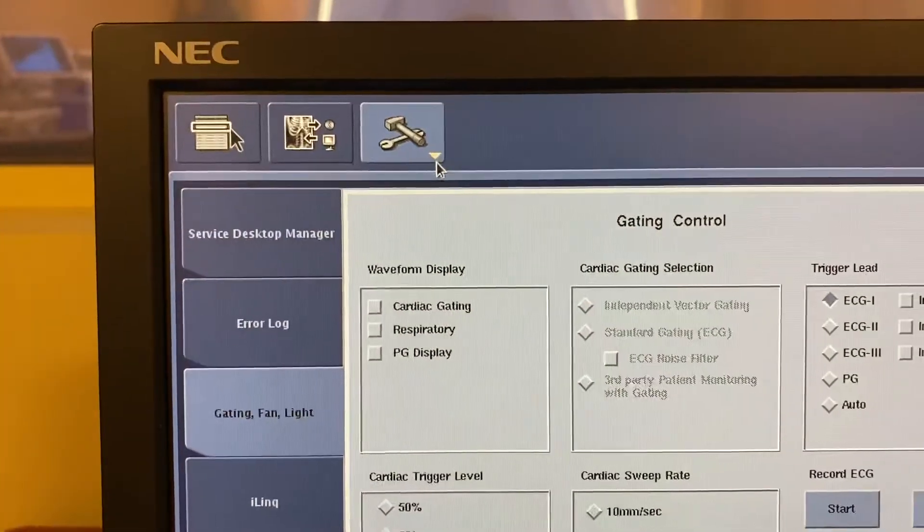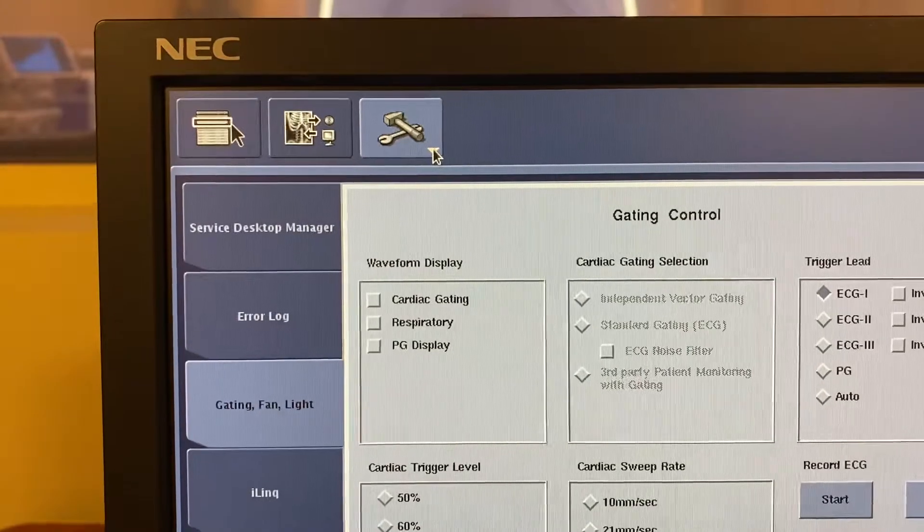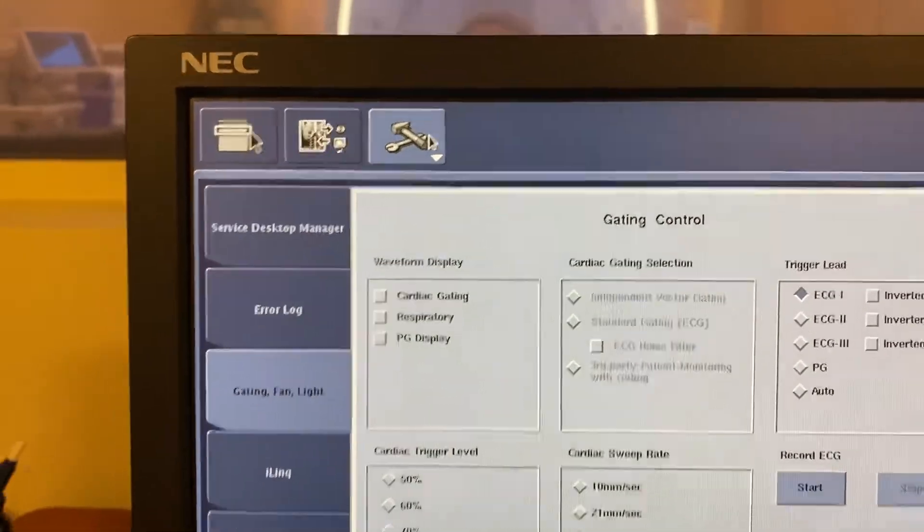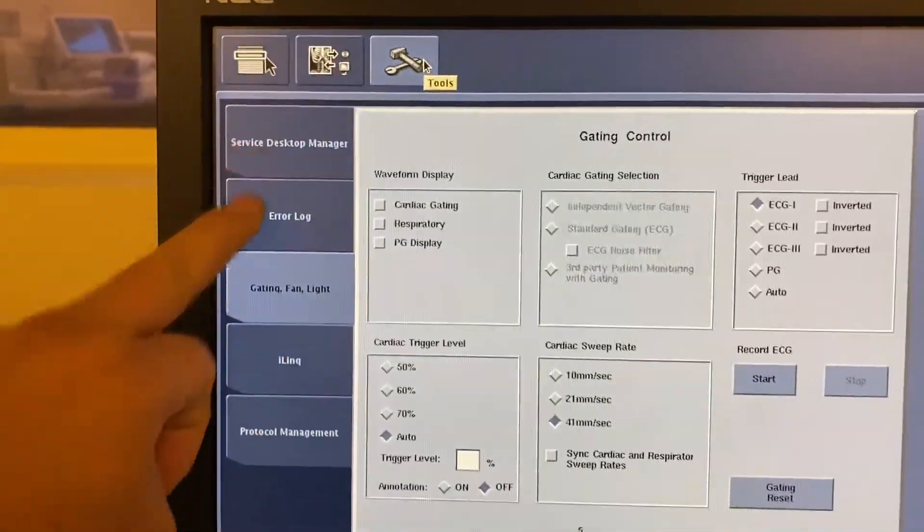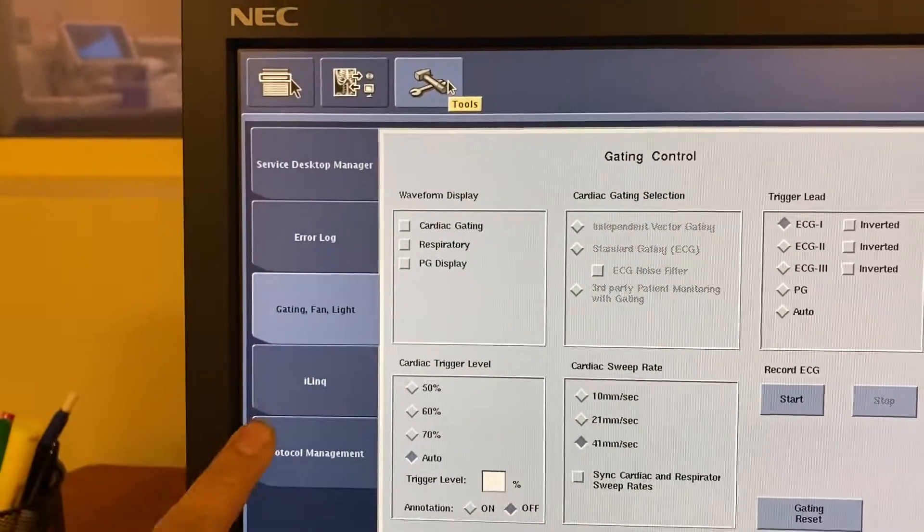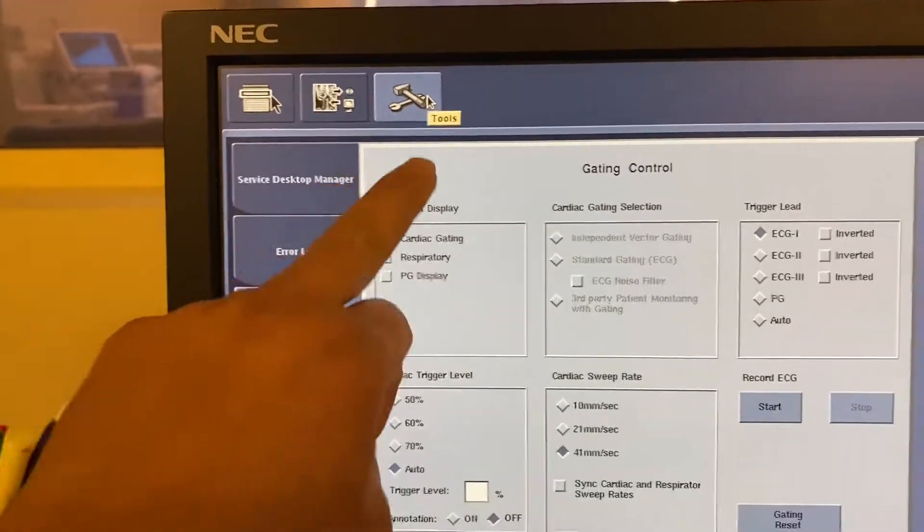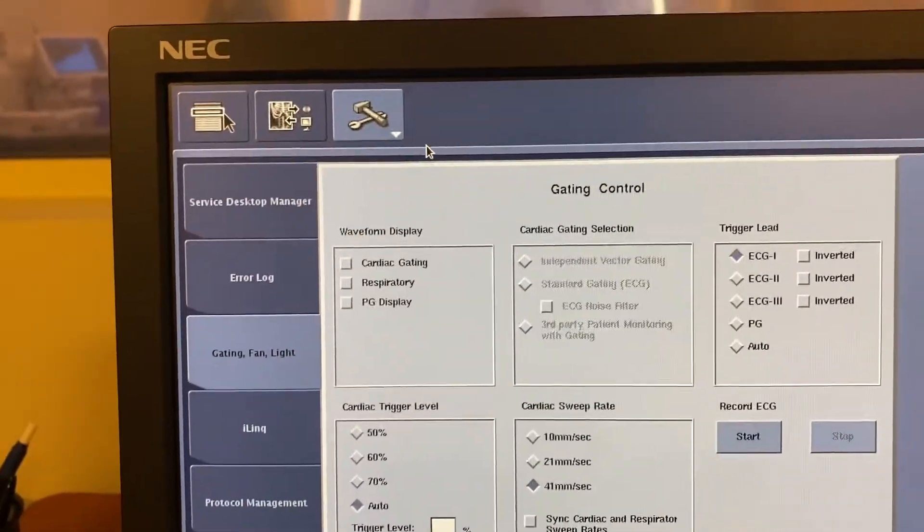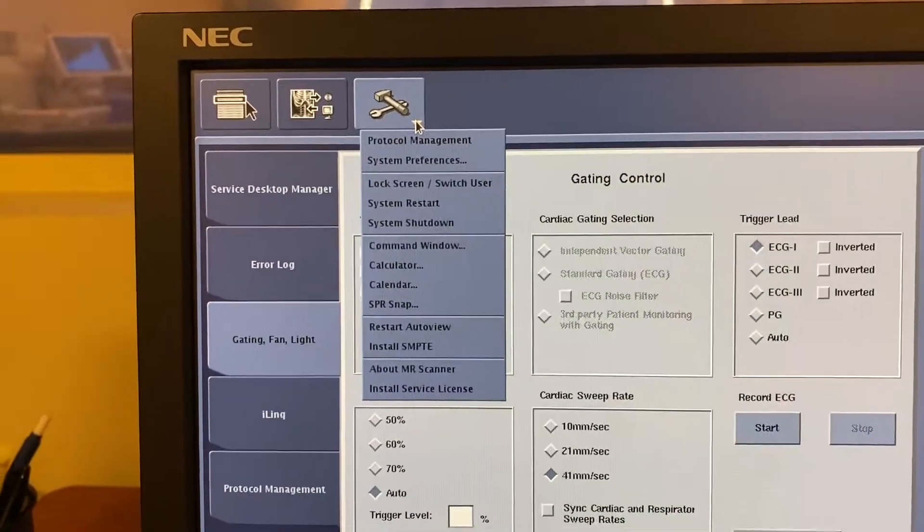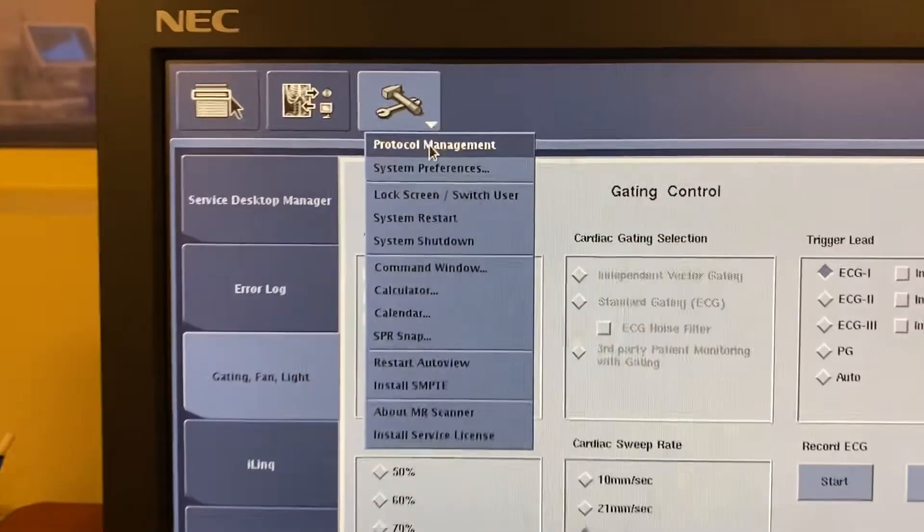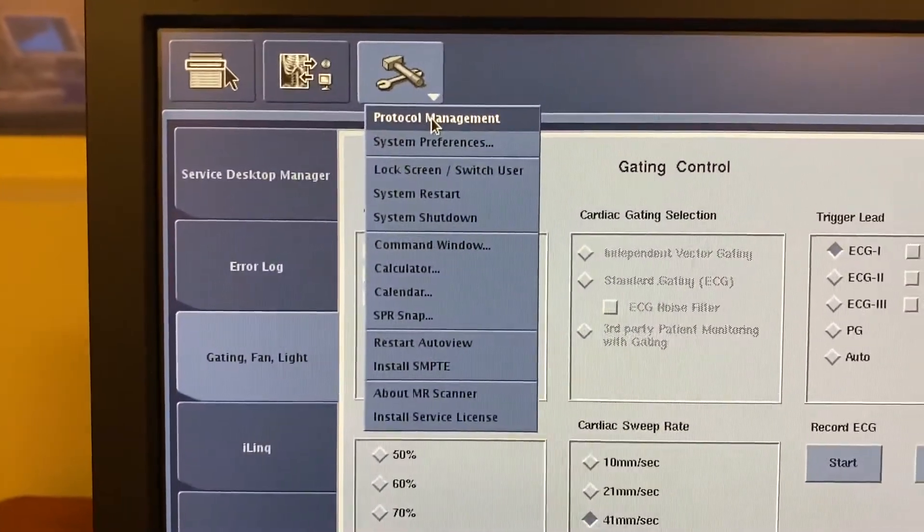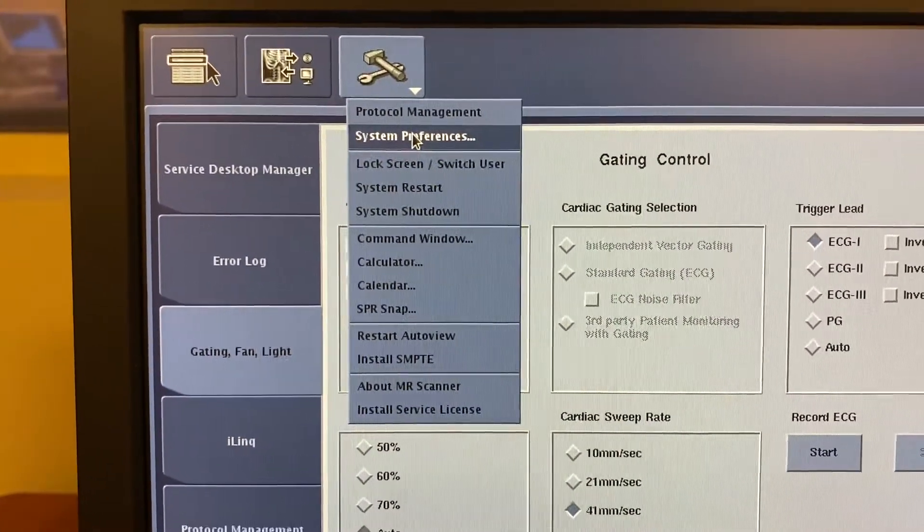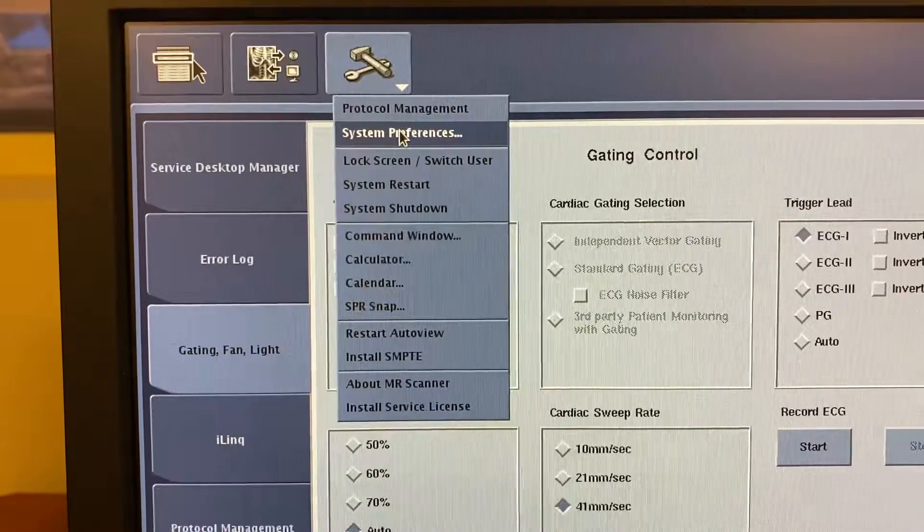You have this little drop-down arrow. When you're in here, you have all these menus, but the menu we're interested in is in that drop-down arrow, which is another set of menus. Here you have the word Protocol Management. Go down to System Preferences right there.